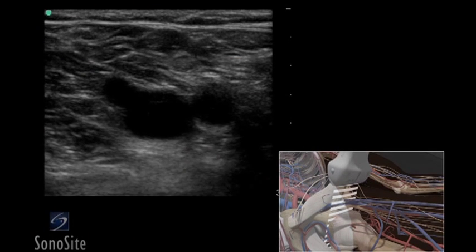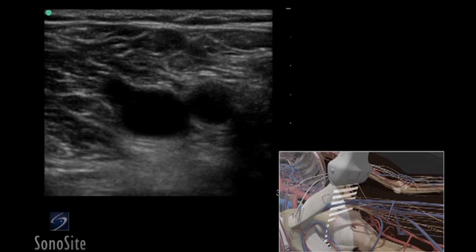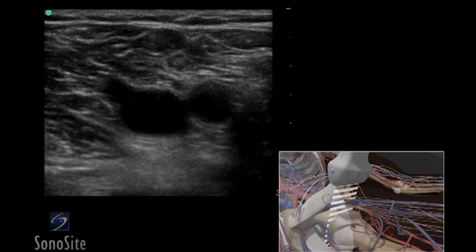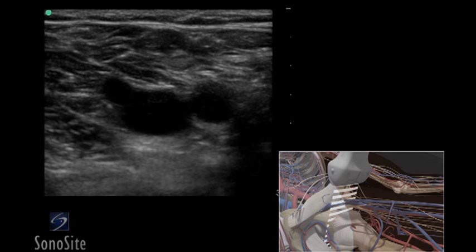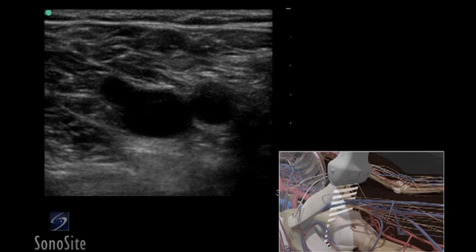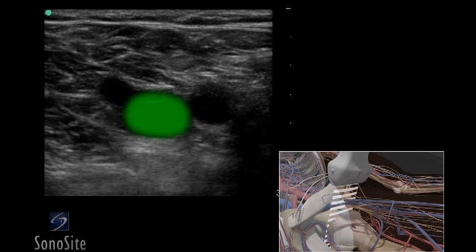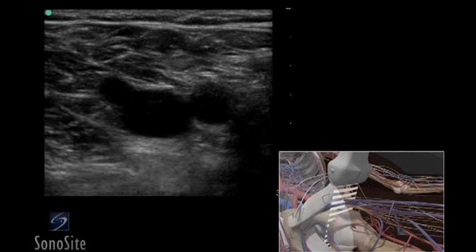The three structures of the femoral triangle are visualized: the common femoral artery, the common femoral vein, and the greater saphenous vein. The common femoral artery is round and pulsatile, and the common femoral vein is thin-walled, oval in shape, and collapsible with compression.